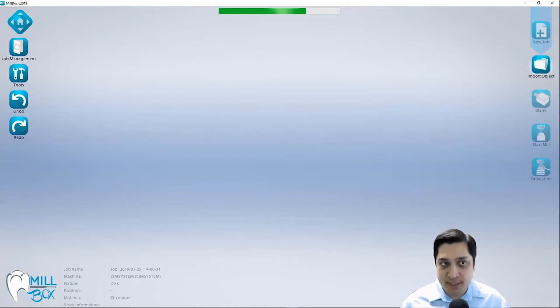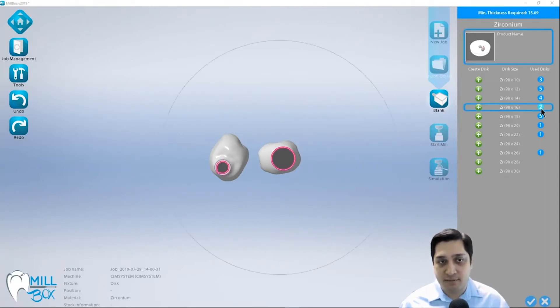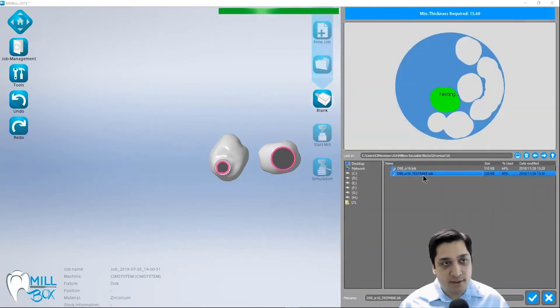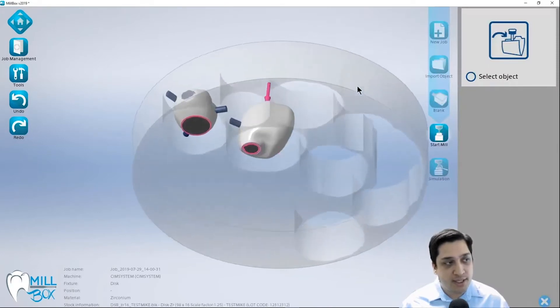The one exception to this is if you're having trouble processing a case as a hybrid abutment and it's a conical shaped interface, then you could also try importing it as an abutment or an abutment bridge. In this particular case I have a minimum thickness required of 16 millimeters, so I'm going to select from one of my 16 millimeter discs and it's going to simply import and nest these parts.